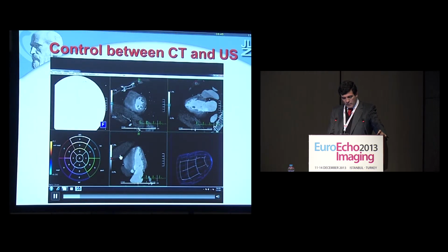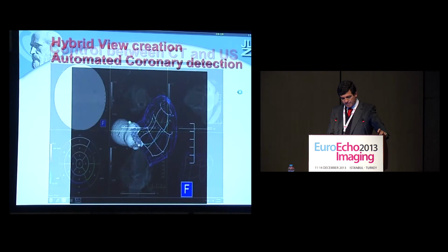So now you can really match and overlap, you can manually control how is the image of the CT, and you can detect your markers, how is the image of the CT and with the echo. So at the end of the day, you are sure that both match in an adequate way. Or if not, you can manually control and redo the matching of both techniques.